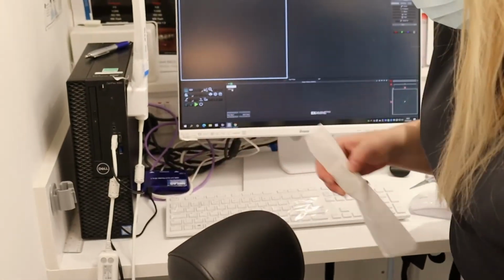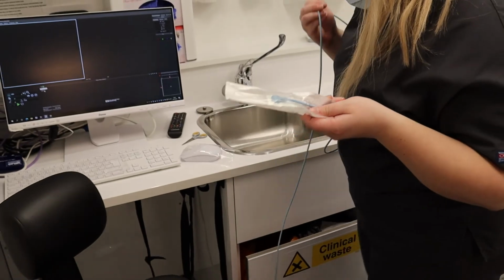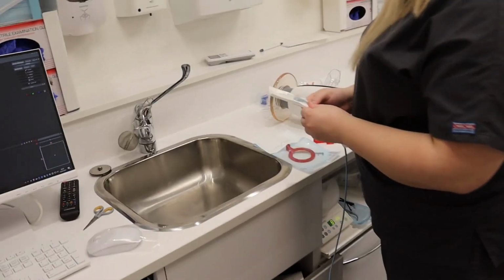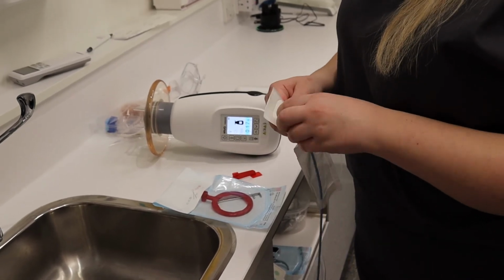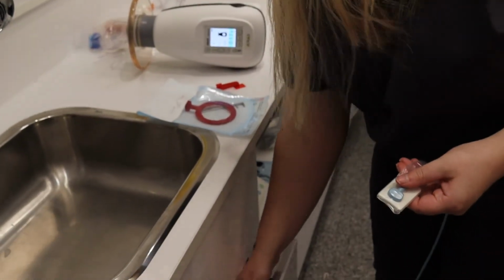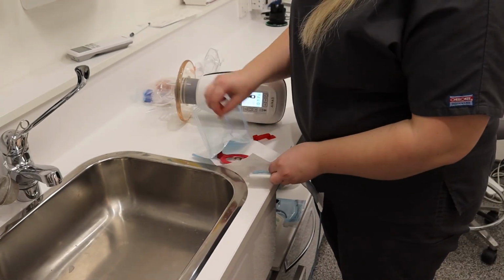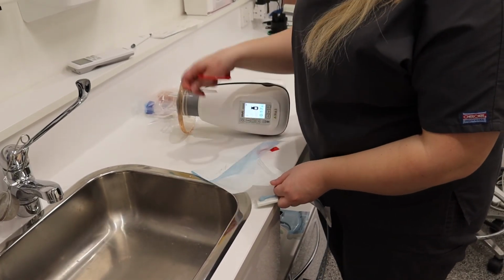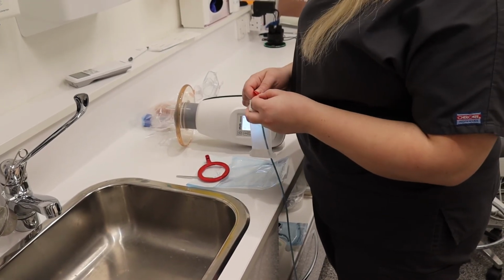Routinely, we advise using a targeting device because it reduces the number of failed exposures. The sensor is prepared using a protective sleeve, which is single use per patient. The sticker that then applies to the sleeve is also single use, and only the frame and the ring are reprocessed for sterilisation.